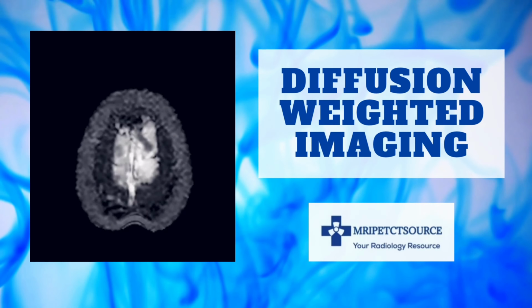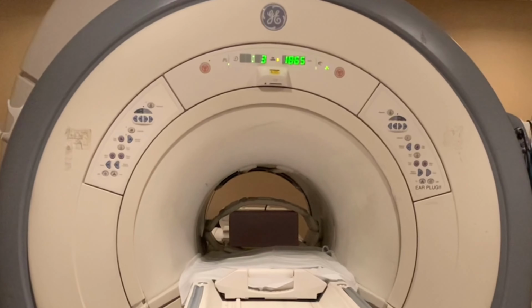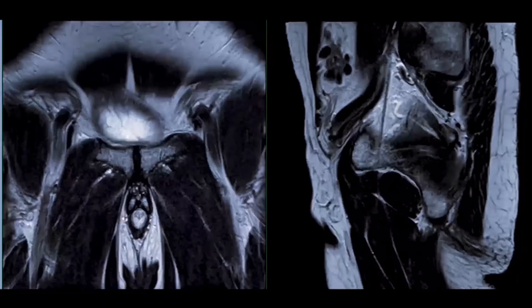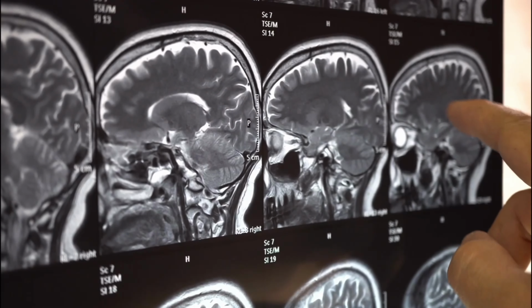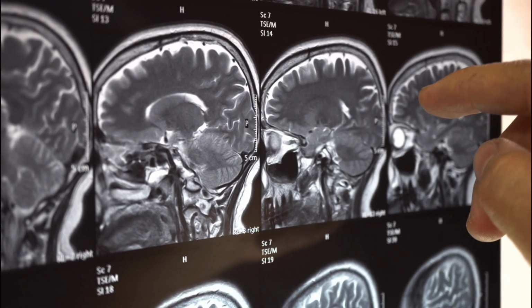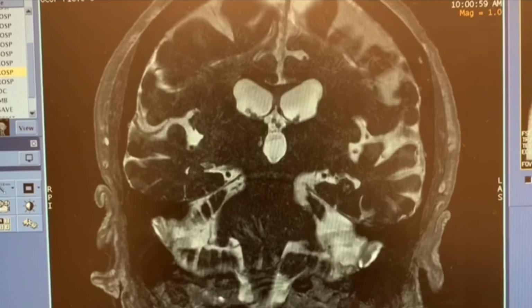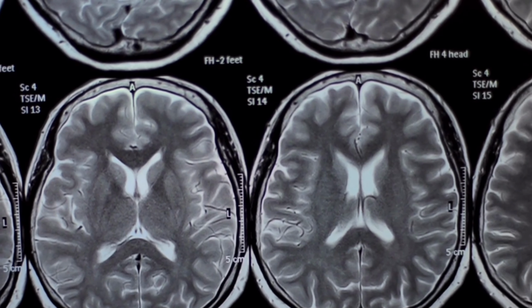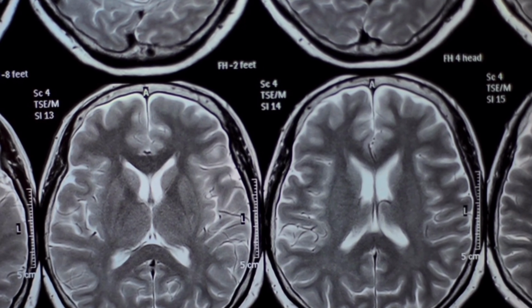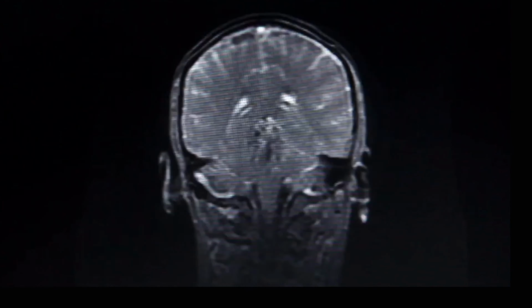In this video, we are going to be detailing the diffusion weighted imaging MRI scan sequence. This single-shot echo planar imaging scan technique gives radiologists the ability to provide a fast diagnosis with improved image clarity. The DWI MRI scan sequence improves delineation when imaging anatomical microstructures and is a powerful diagnostic imaging technique that has specialized imaging applications in diagnosing multiple sclerosis, evaluating cancerous growth, and assessing cerebrovascular accidents. Join us as we explore the DWI MRI scan sequence.